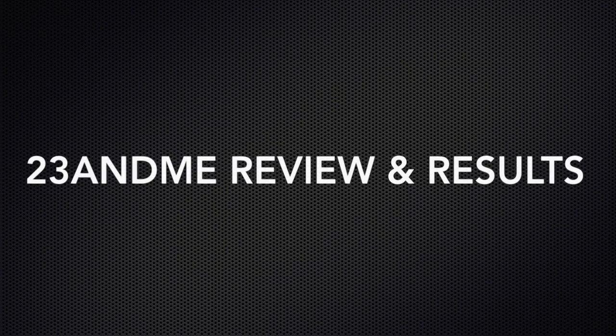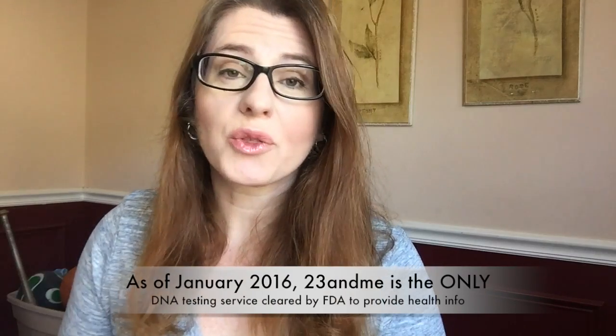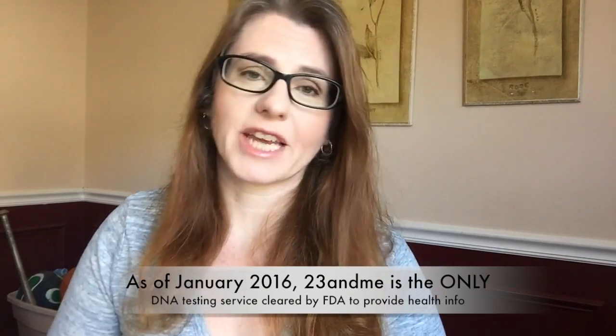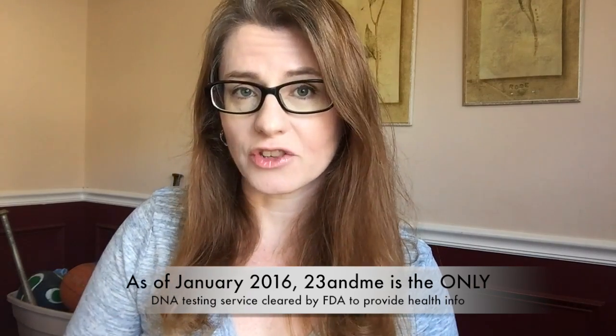Buckle up and put your geek hat on. Be warned: 23andMe testing is not cheap. You're going to pay $199 to get your kit, mail it back, and get all of your results. When you do go through 23andMe, you're not only going to find out where your ancestors came from — you'll also find out if you're a carrier for certain inherited conditions, some other neat wellness reports, and just all sorts of goody-goody gumdrops that I'm going to show you later.